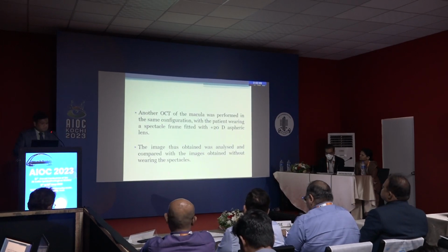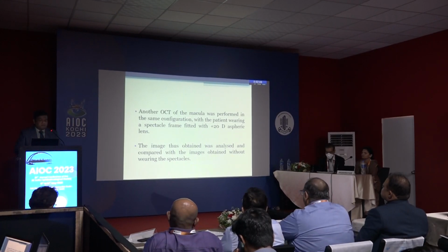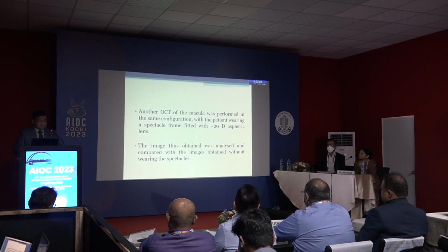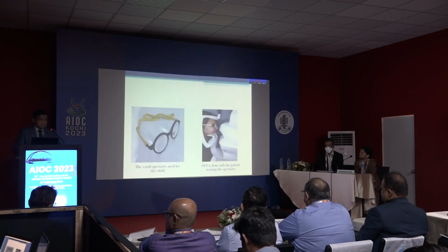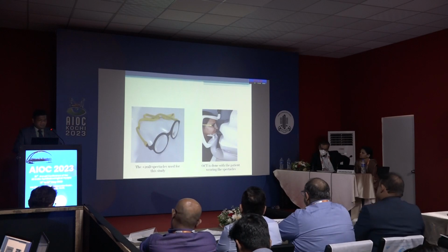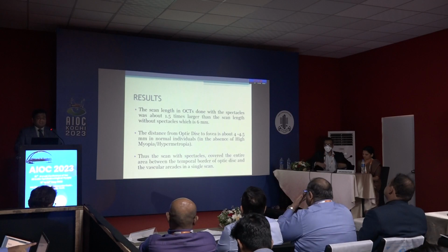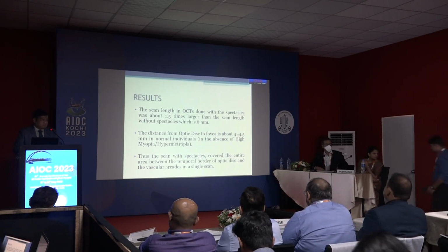Now, another OCT was performed in the same configuration, but with the patient wearing +20 diopter aspheric glasses. The image thus obtained was analyzed and compared with the images obtained without wearing the spectacles. These are the glasses which we use for the patient, this is how the patient sits in front of the OCT wearing the glasses. The scan length in the OCTs done with the spectacles was about 1.5 times larger than the scan length without the spectacles.